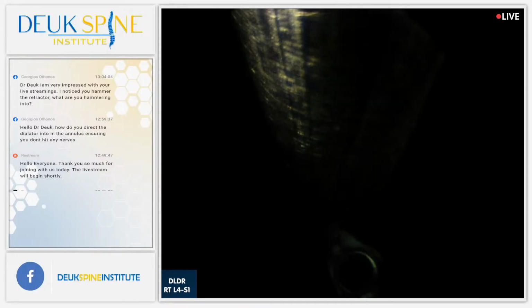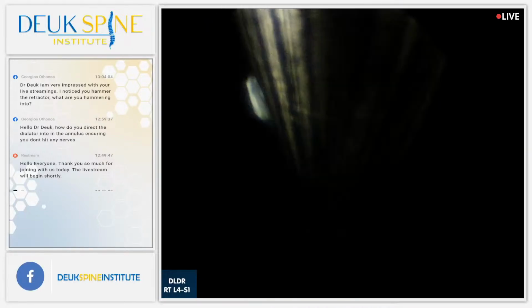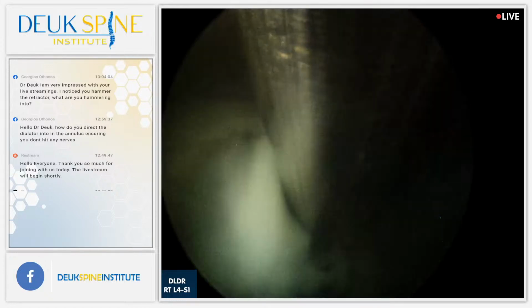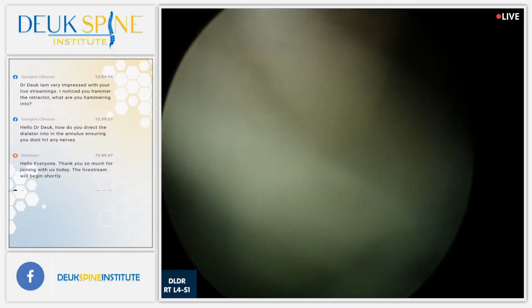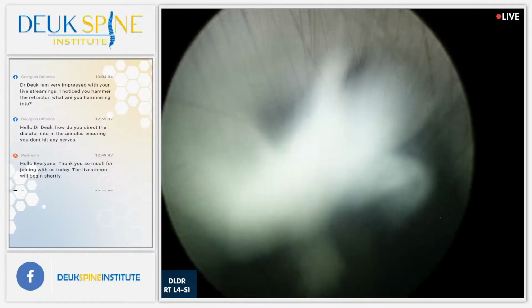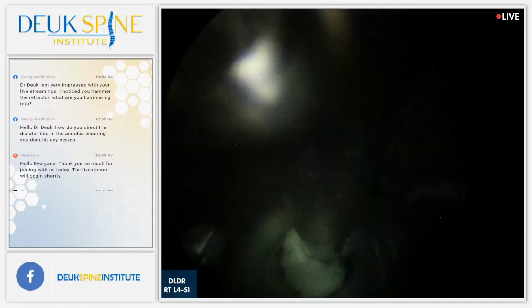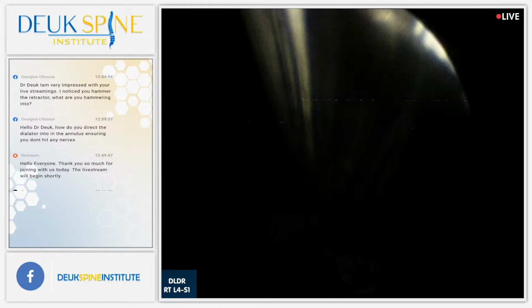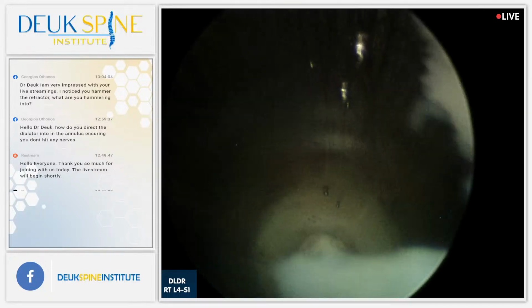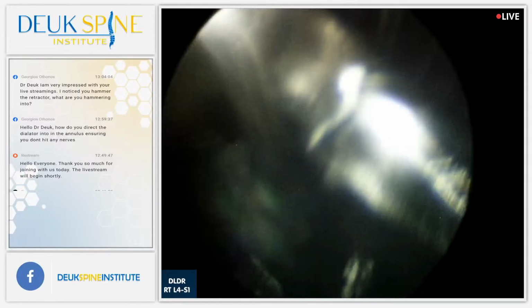A hammer allows the surgeon to deliver a very specific amount of energy or force to the tool. And it allows me to drive it forward, gradually. Now, of course, I'm not hammering it like you hammer a nail into a roof, I'm actually feeling every hit, and I'm feeling these are all big pieces of herniation. I'm feeling the tube slide forward. So it's not the same as hammering a nail or something, but it's kind of the same.